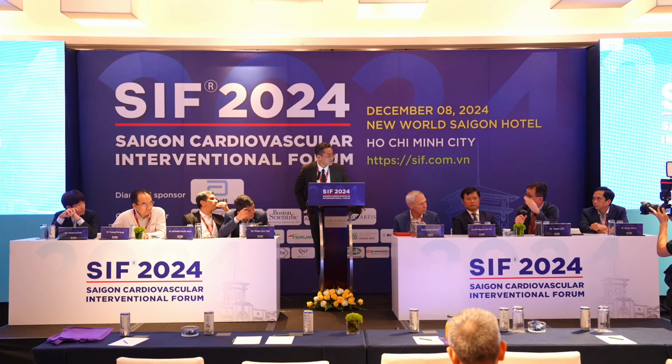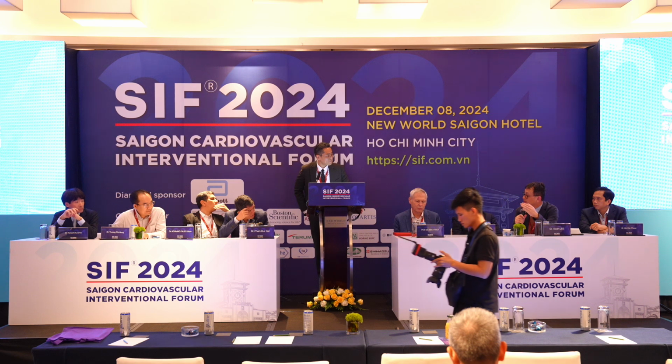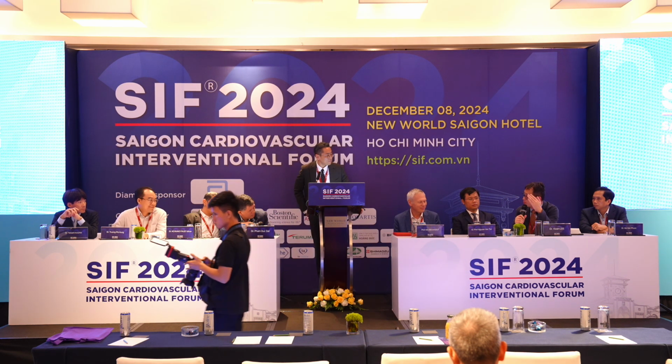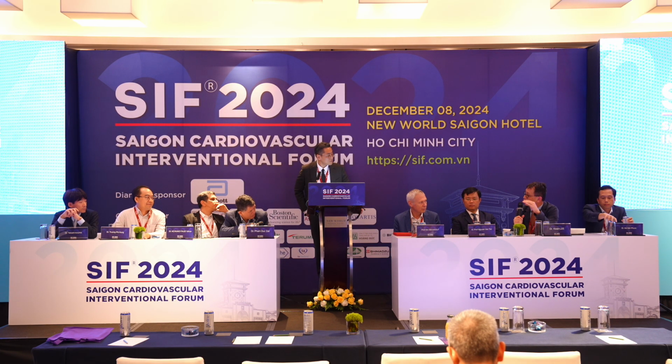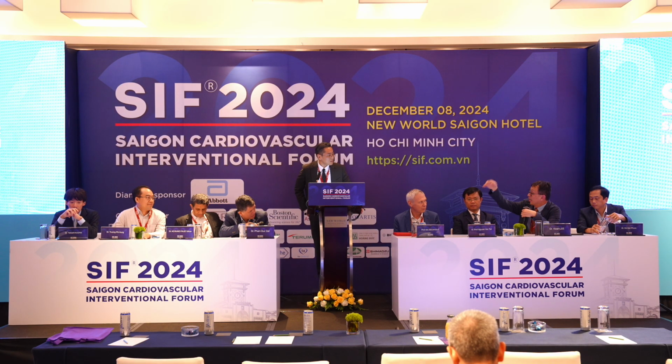And then I think the primary mistake that the operator made was when they pre-dilated, there was a clear dog bone that never resolved. And when you see that, you should not implant a stent until you see it go away. I think that was the fundamental error that this operator made. And then I noticed that when they first tried to expand the balloon, they used a cutting balloon. No, it's a semi-compliant balloon. Or semi-compliant, but then they went to a cutting balloon later on.